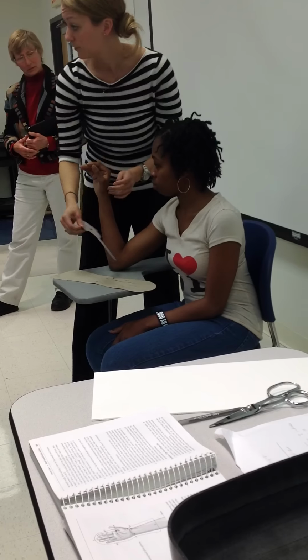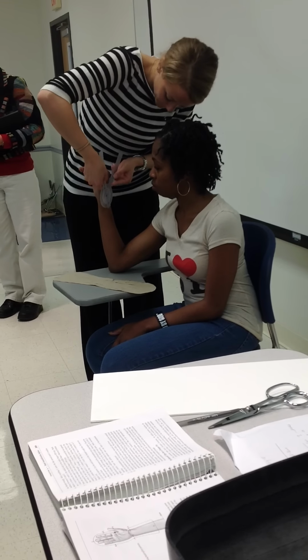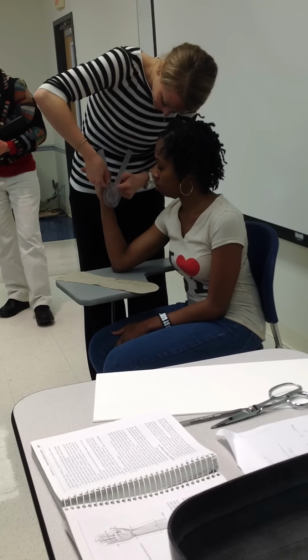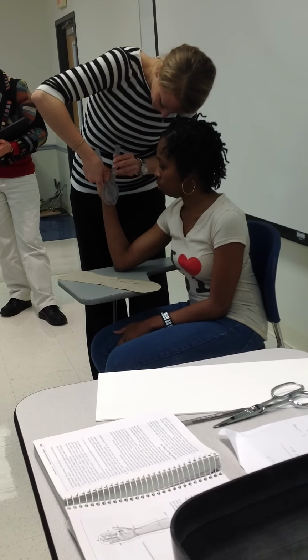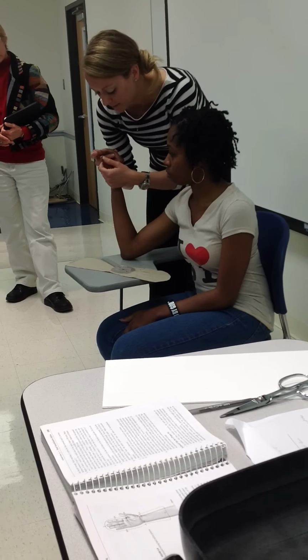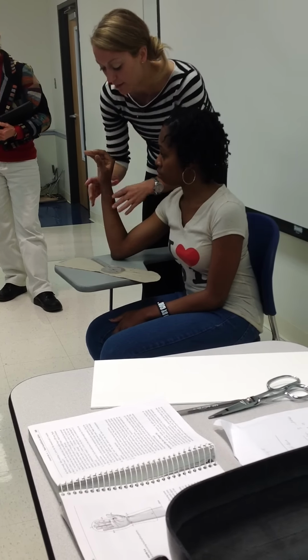I lost my spot. I'm 10. Okay. So then just so she's 10 and 10, barely there. And then thumb is 45. Palmar, she's probably pretty close right there. Yeah, so she's about 40 right there. So that's pretty good positioning right there.